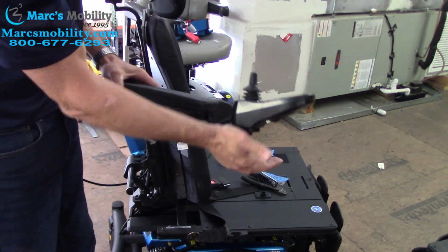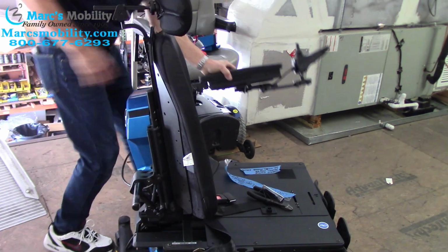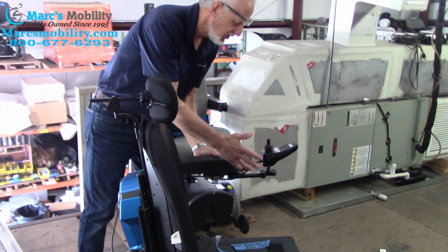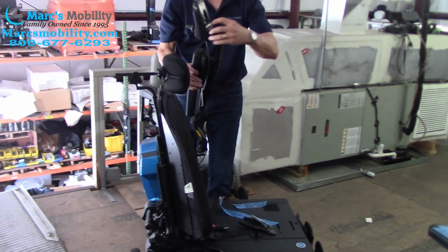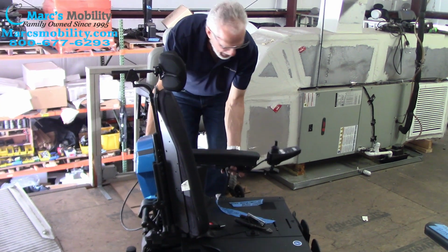And we're going to send you another arm like this that's going to be on the left side for here, where it will swing out this way. So it'll be in the box. So you'll get a whole left arm. You'll just put the joystick back on here and you'll put the arm back on the chair.